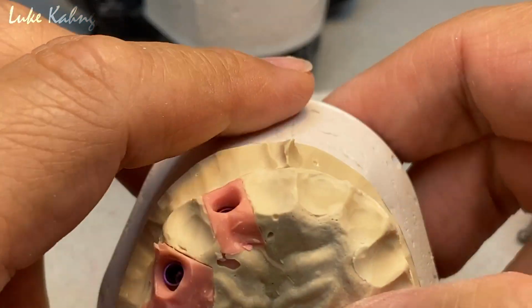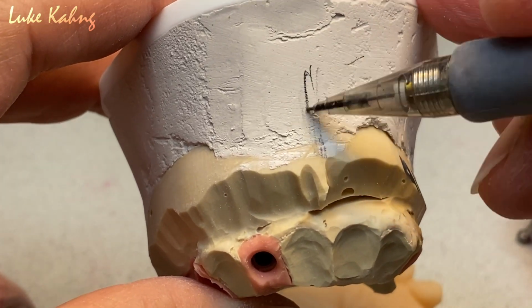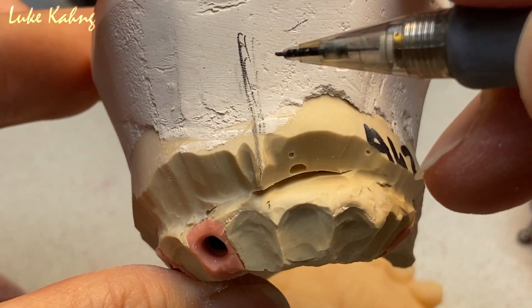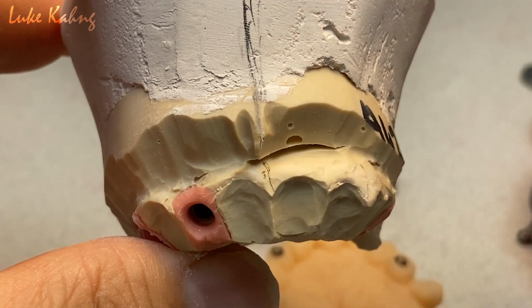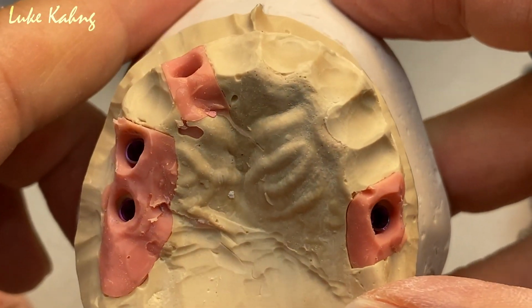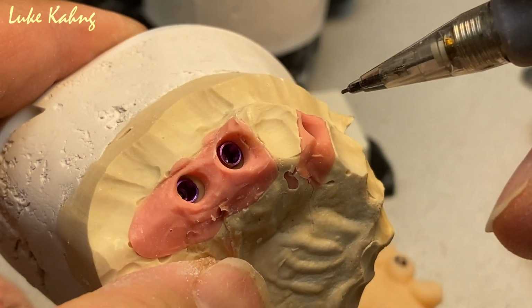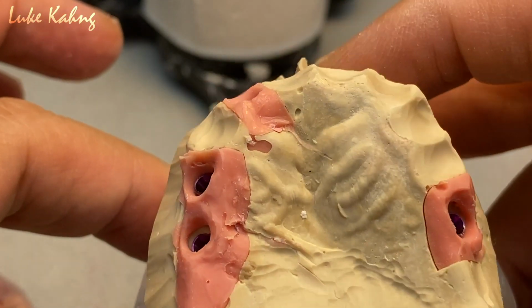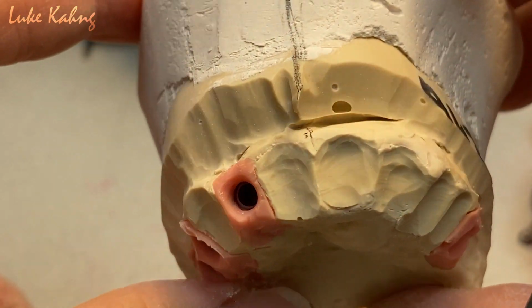Alright, so we're going to open the vertical, and then we check the midline just like here. Previously we can maintain. I am grinding intentionally like this. Okay, so we can make this better contour. So now I'm going to show you how to design the PMMA, which is pretty easy, scan and design. We put it in the scanner and then design it, and then we can either make milling or printing.